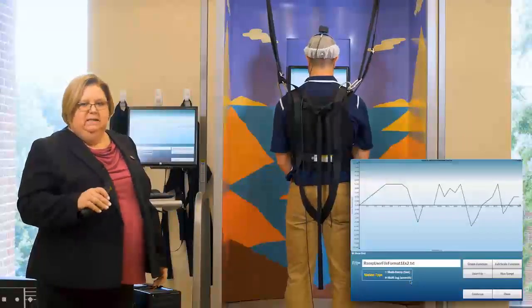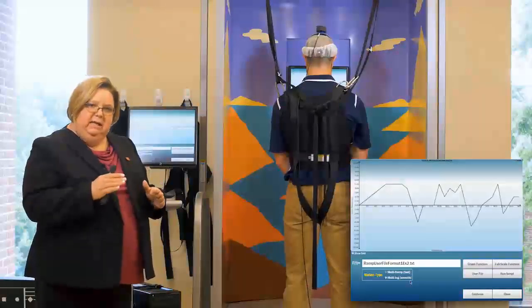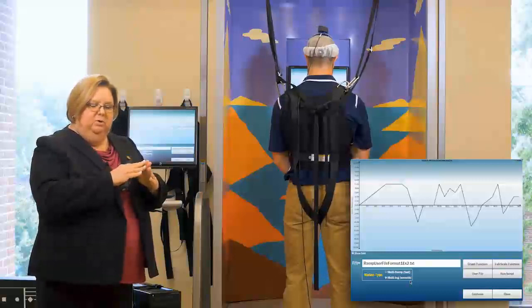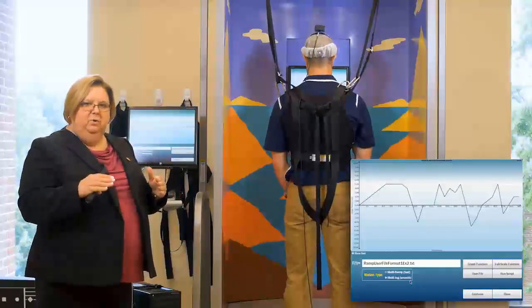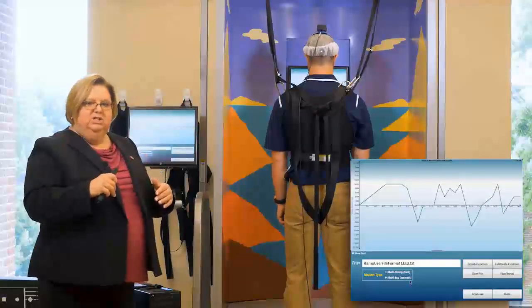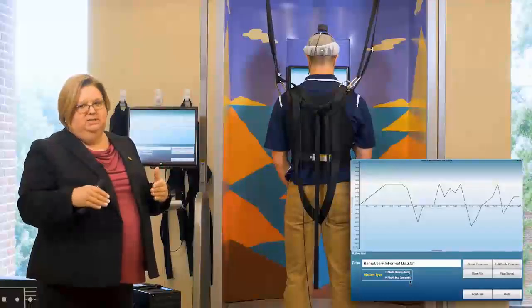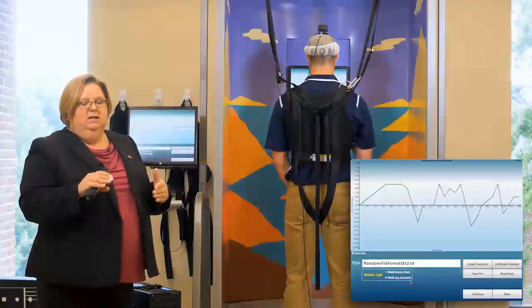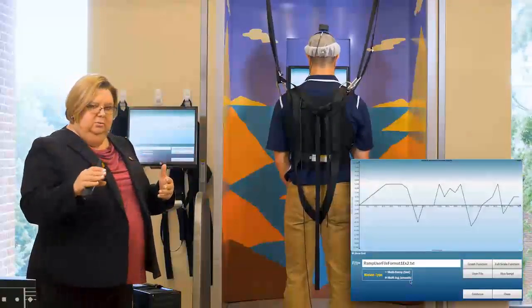What it means is it's going to take into account the acceleration needed and make sure that the motors are in a position to get that velocity you're asking for, even if it has to push it out a little bit. Multi-jog takes into account position and is going to hold the position still, or accurate. And so it's going to be a smoother movement.